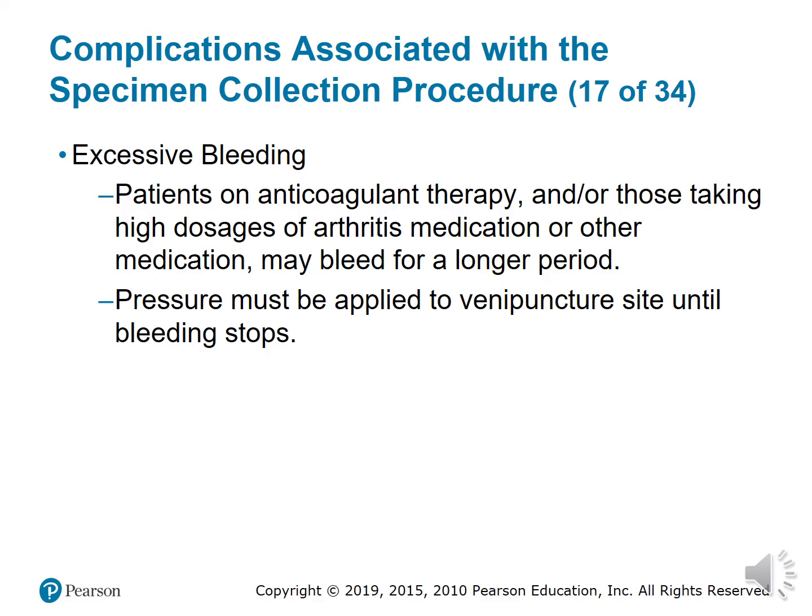Excessive bleeding can lead to shock or even fainting, so it is very important to monitor your patient once you have completed the blood collection. Make sure when you have a patient who is currently on blood thinners that you take the time, instead of maybe the 1 to 2 minutes you sometimes have to do in order for them to stop bleeding. Sometimes it may take 2 to 3 minutes or sometimes 4 to 5 minutes for them to stop bleeding.